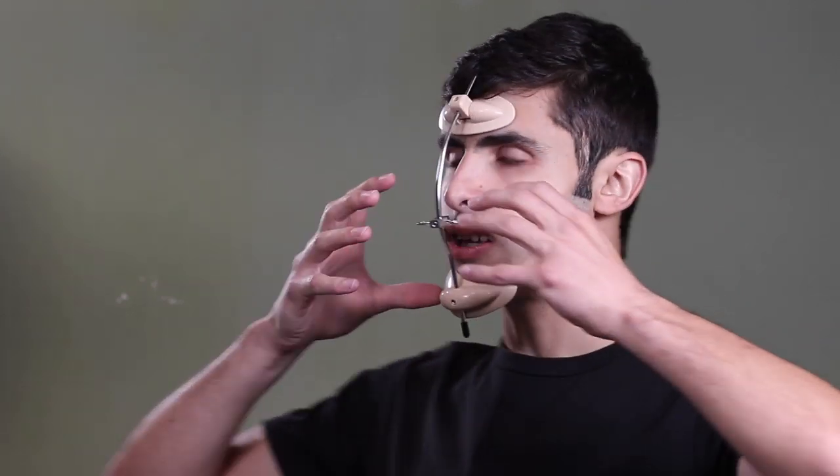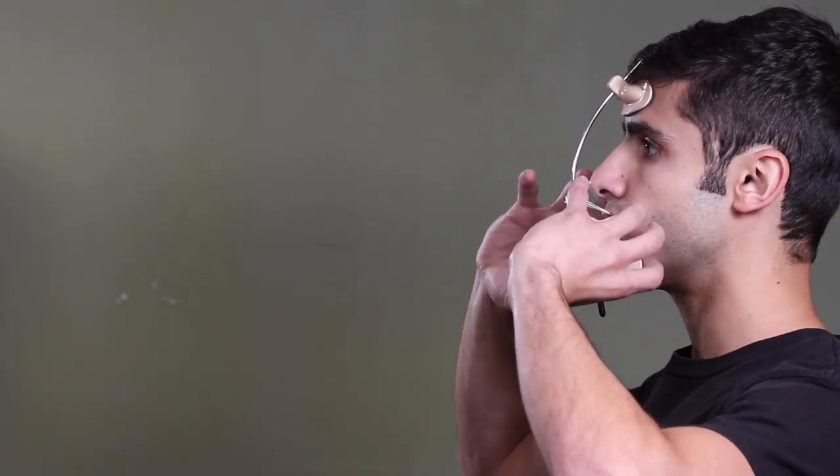So when we're pulling on the maxilla with the face mask, we want to make sure we're applying counterclockwise tension to it to hopefully correct some of the clockwise rotation built into our maxillas. This is going to upright the maxilla, shorten the face, and get us into a healthier position. In double jaw surgery, when they cut the maxilla, they don't just move it forward — they cut it, move it forward, and rotate it in this direction, which is the same direction the elastics of the face mask are pulling in.